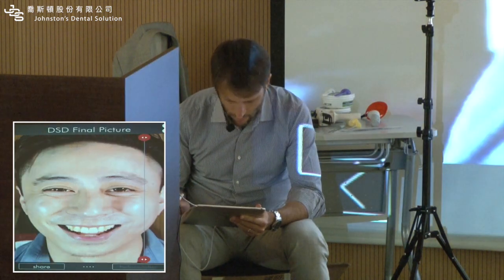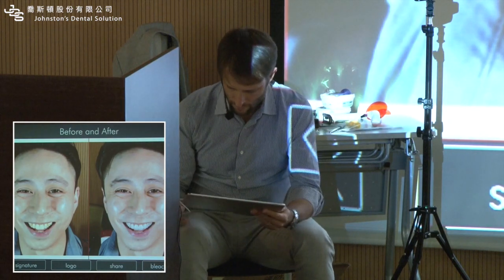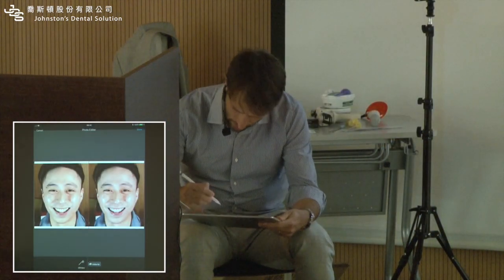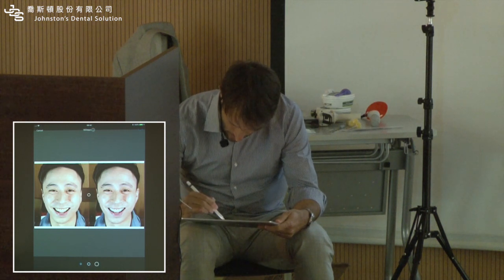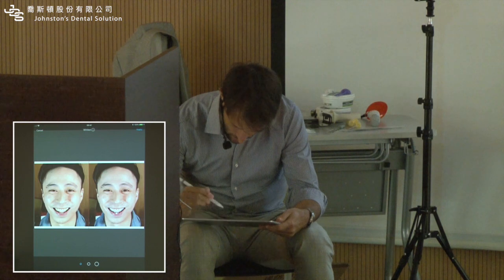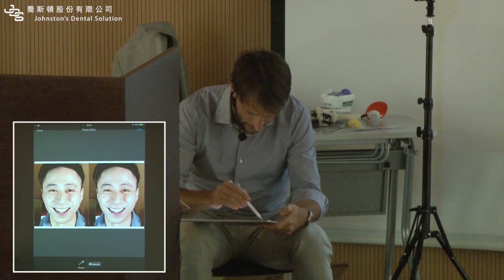And then this. You could bleach the lowers as well. If I click here, there's not much of the lowers here, but I could bleach the lowers if he was showing more. Okay? Apply. Done.